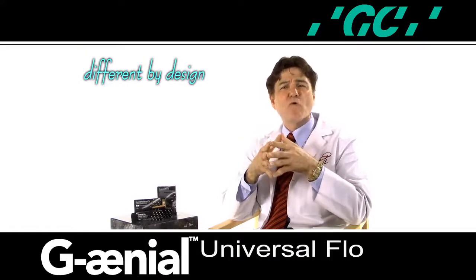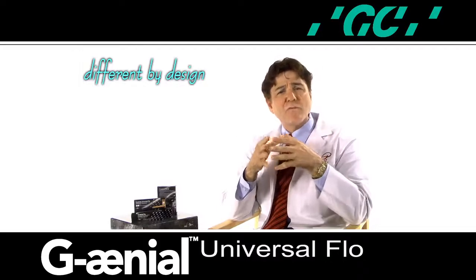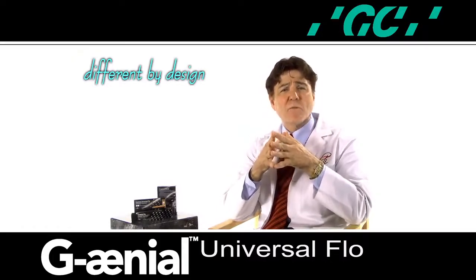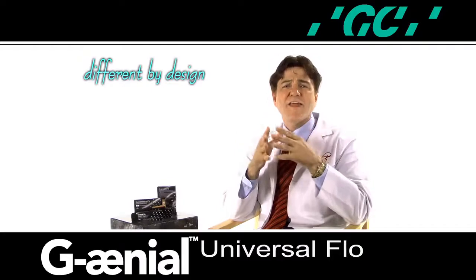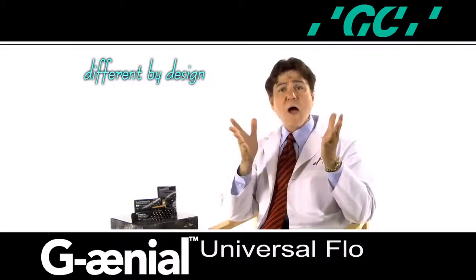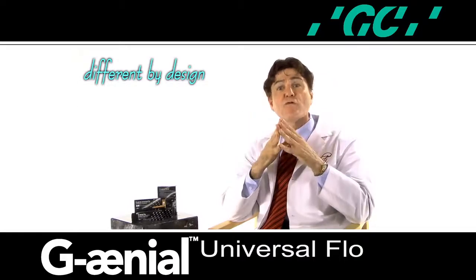A clear vinyl polysiloxane impression can be used to replicate the diagnostic wax-up. The matrix can be placed intra-orally and used as a transfer vehicle for the flowable composite to be injected and cured. After adjustment and polishing procedures are completed, the transitional restorations can continue to be modified to satisfy the functional and aesthetic needs of the patient. I would like to share with you this technique utilizing a new next-generation flowable composite, Genial Universal Flow.